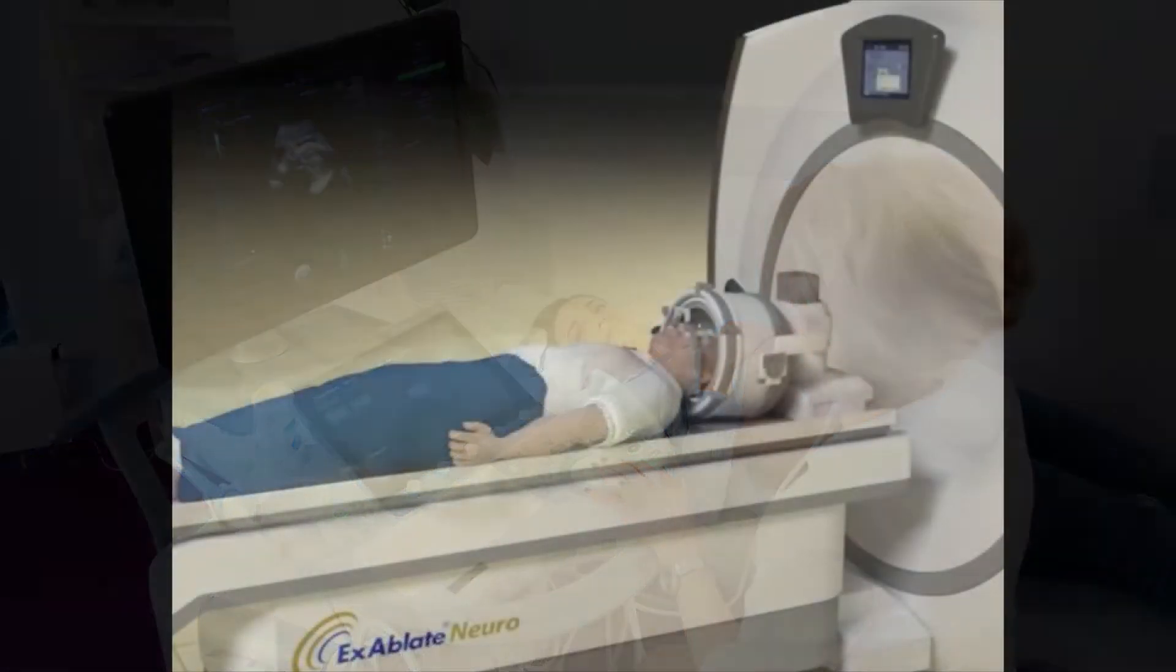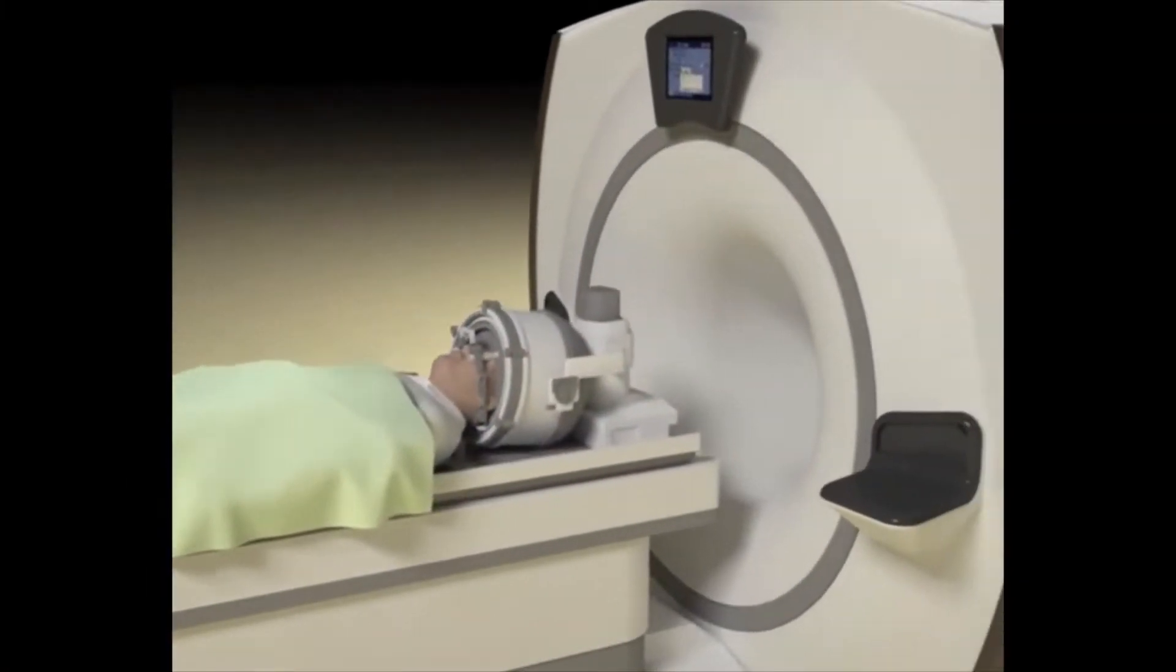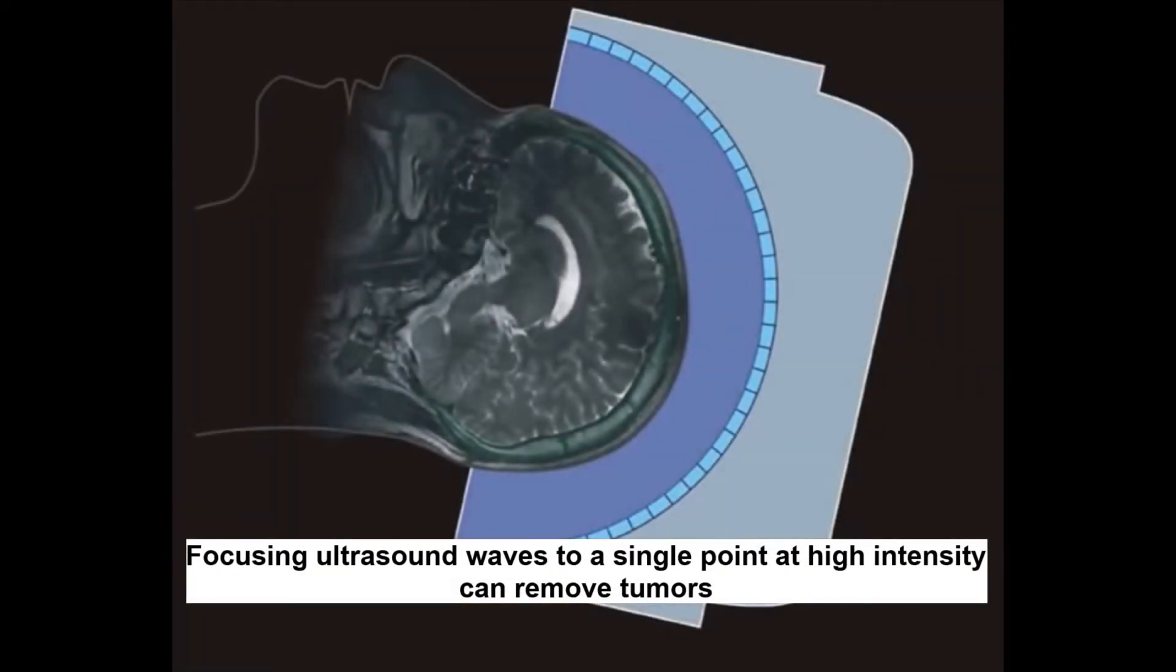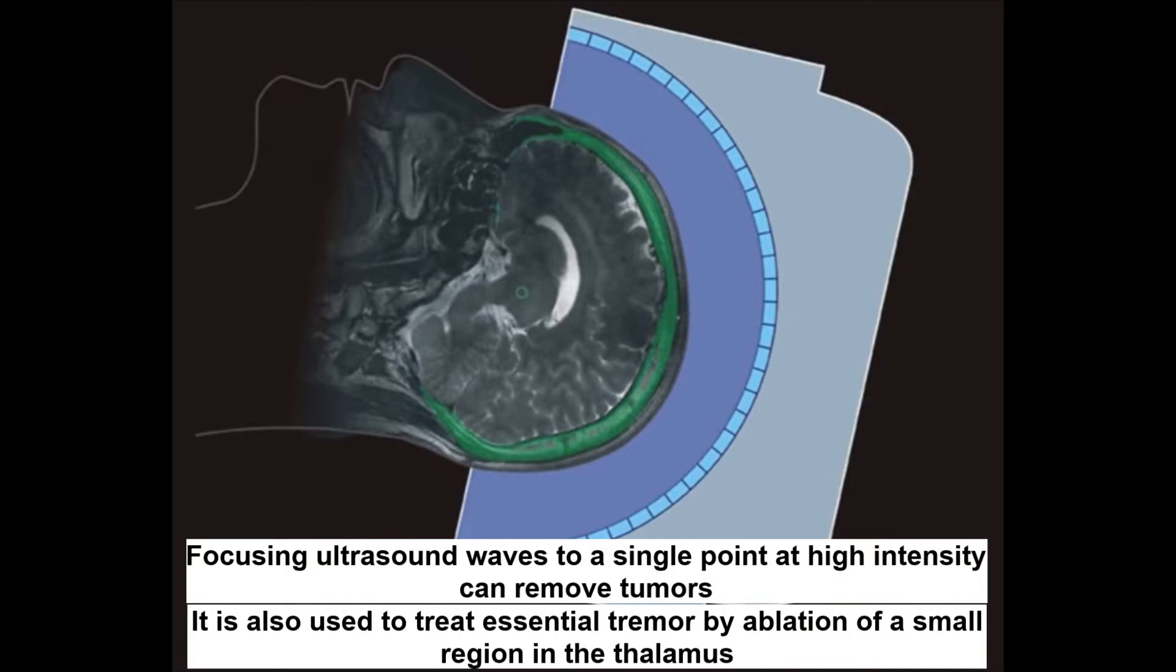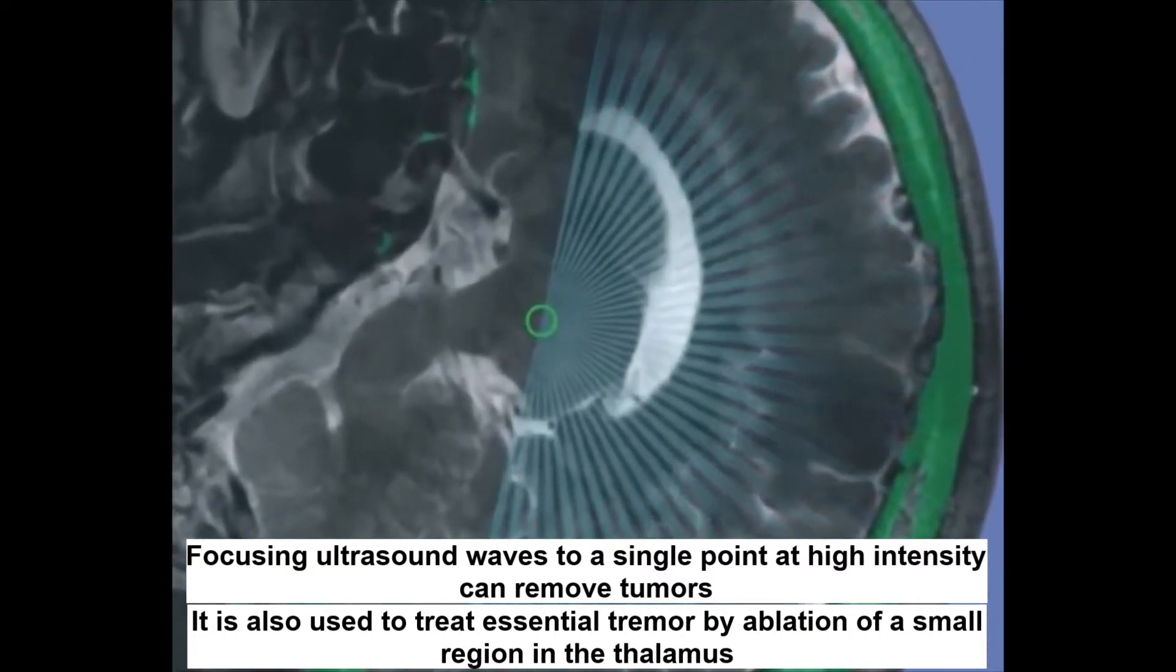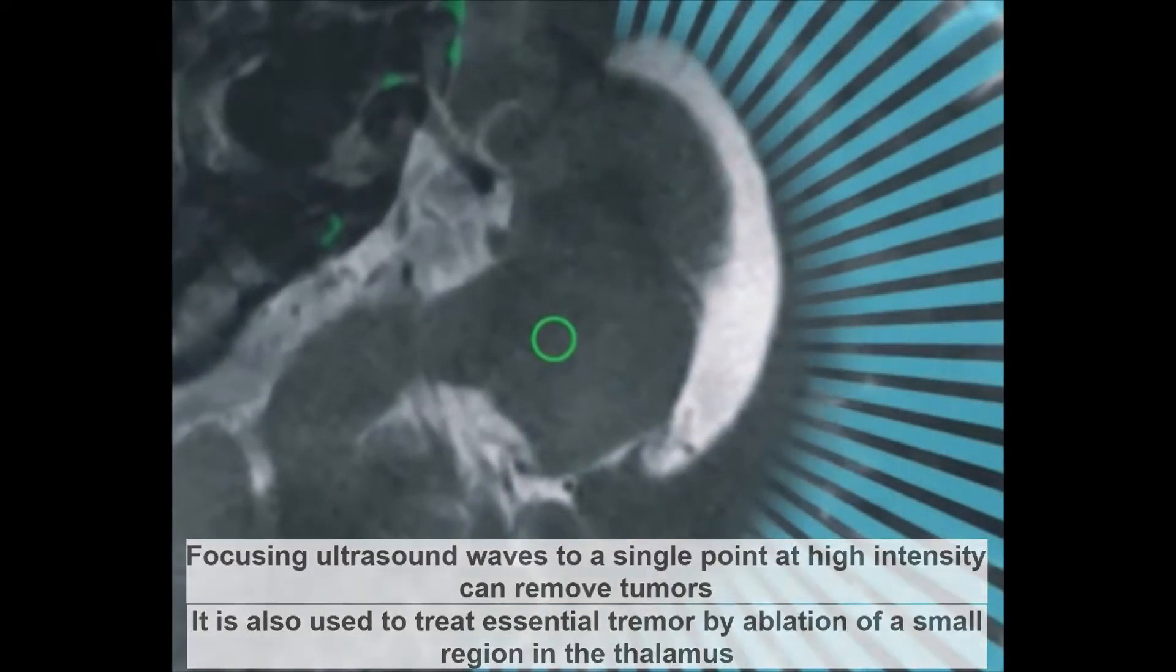By focusing ultrasound waves to a single point and using it at a high intensity, tumors can be removed. But how is that possible? By creating a focal point, a lot of energy is created in a single spot. If this intensity is high enough, malignant cells can be destroyed.